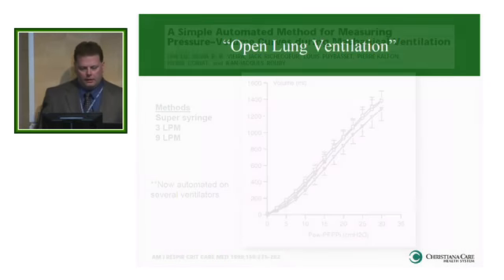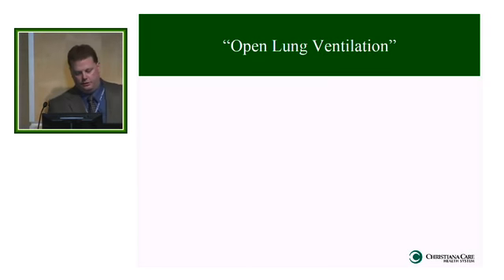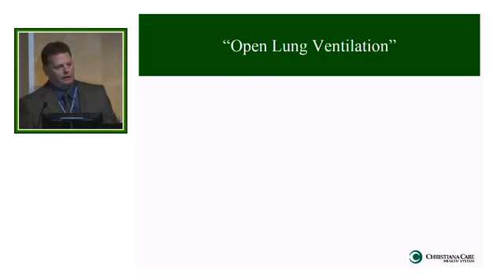Now, I want to hit a topic that's called open lung ventilation, and I'm using that term loosely, but here's what I'm going to wrap around it: there are some people out there who have done studies where they've mixed and matched methods that I've already talked about. They throw in recruitment maneuvers with differences in PEEP, maybe decremental PEEP trials, and their goal is to manage the patient with open lungs, similar to what Dr.